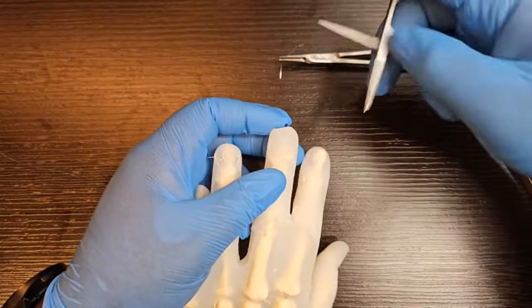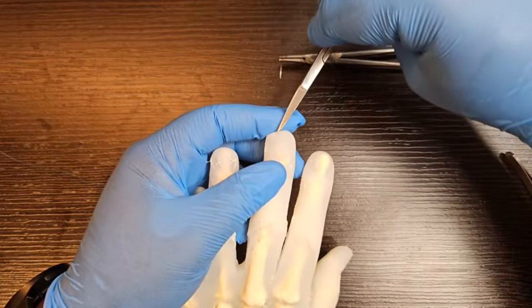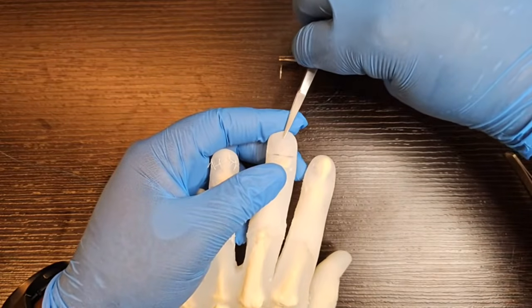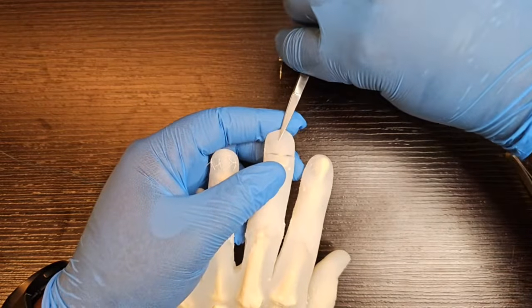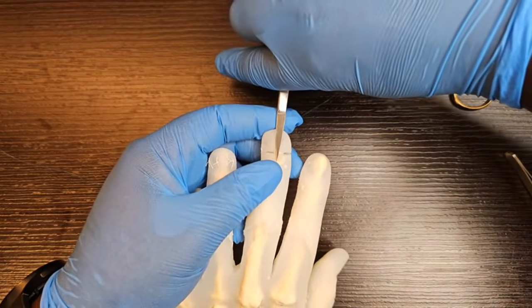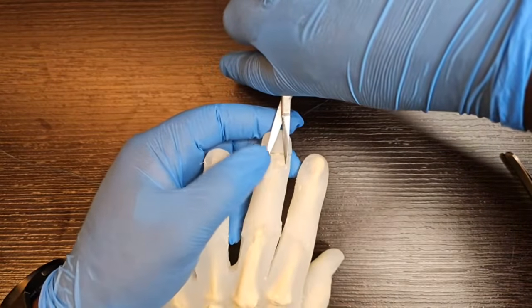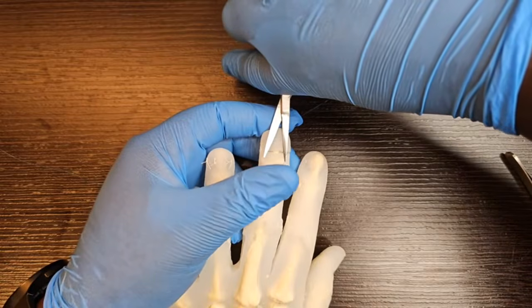Push, push, push. You then need to go underneath the nail plate, so on top of the hyponychium, underneath the nail plate, on top of the nail bed. You see the scissors hit the top of the nail plate underneath. You push them all the way to the back. It's a bit tough. You have to push with a bit of force. And then my technique is just to open the scissor fully. And because I've released all the folds on the top of the nail plate, you see it ping up.